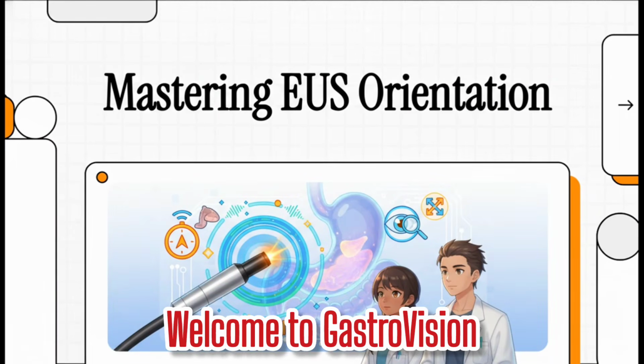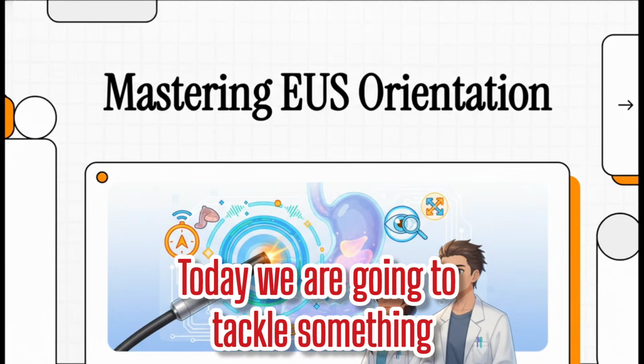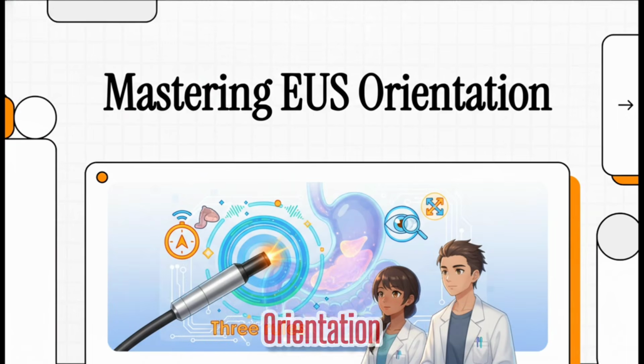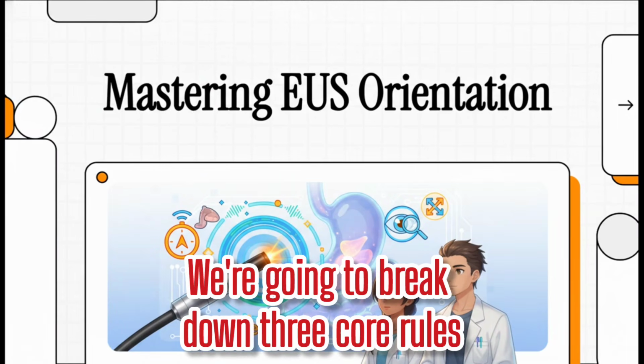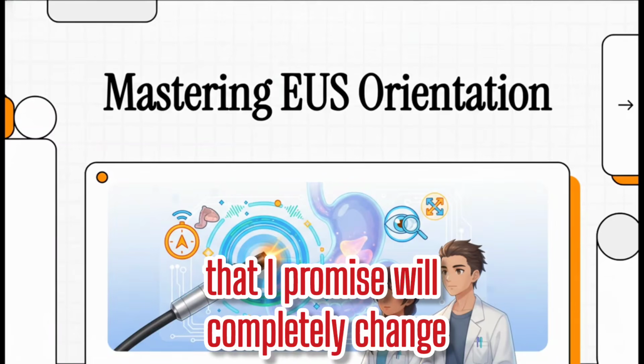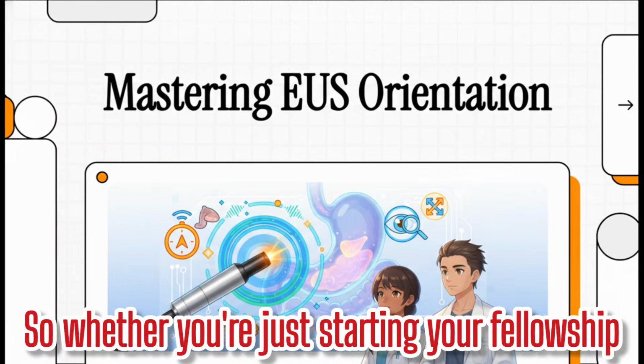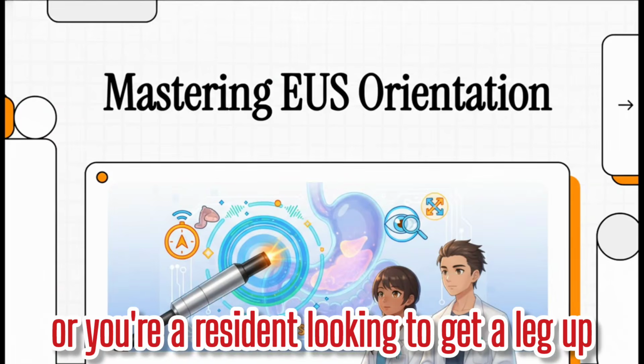Welcome to Gastro Vision. Today, we are going to tackle something that is absolutely fundamental to endoscopic ultrasound: orientation. We're going to break down 3 core rules that I promise will completely change how you navigate your images. So whether you're just starting your fellowship or you're a resident looking to get a leg up, this is for you.